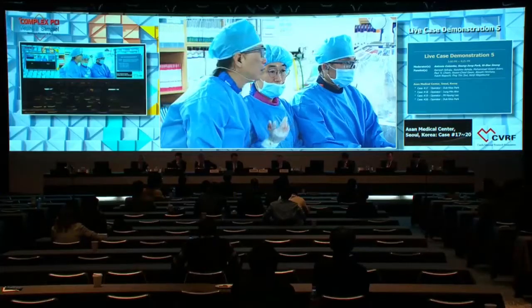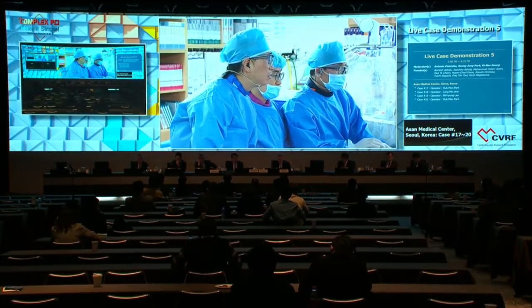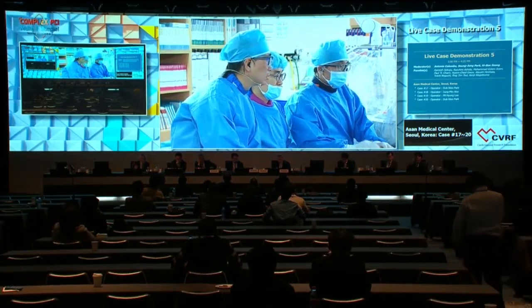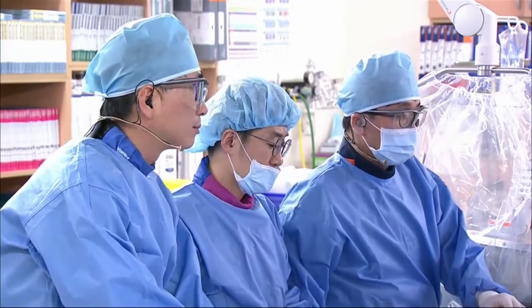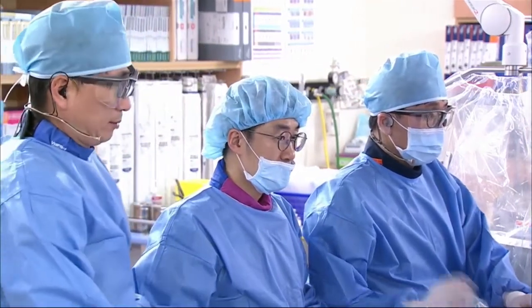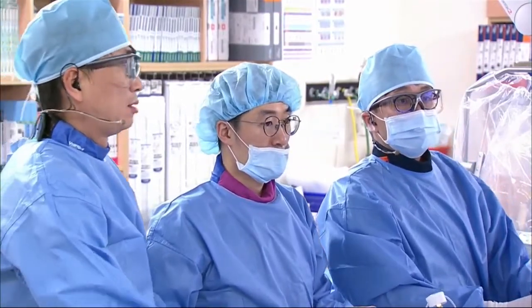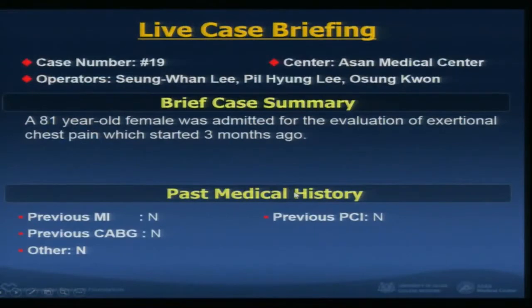Dr. Lee, can you hear me? Yeah. Great. Okay, hello. Good. This is room number 4. Alright. Would you explain your case first? Okay, this is a critical point, so I will just do my stenting and then explain our case. Yes, going in. 11, 12. Okay. Could you explain our case, please? Yeah.